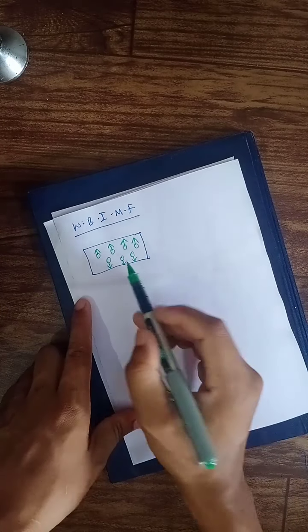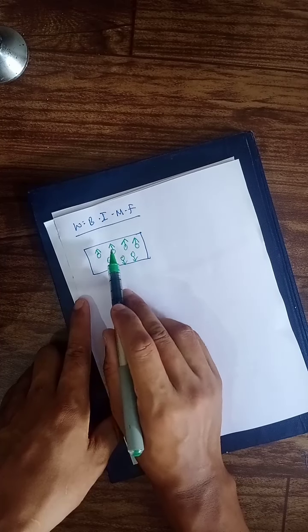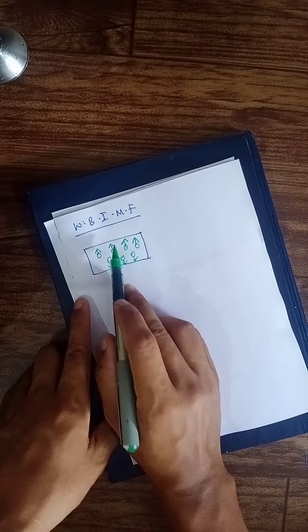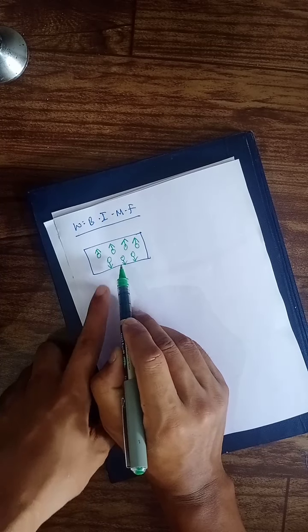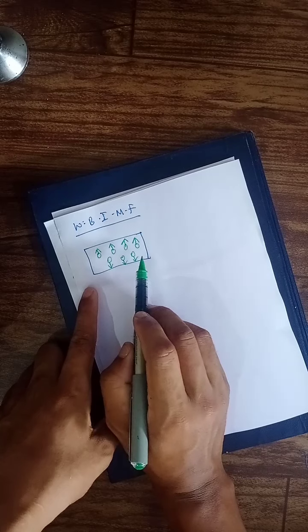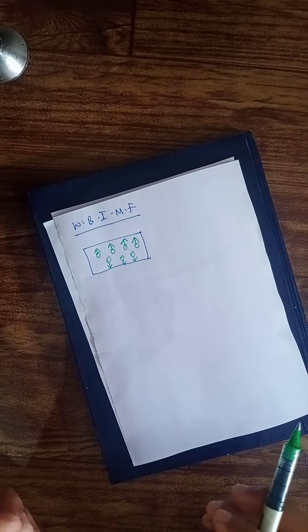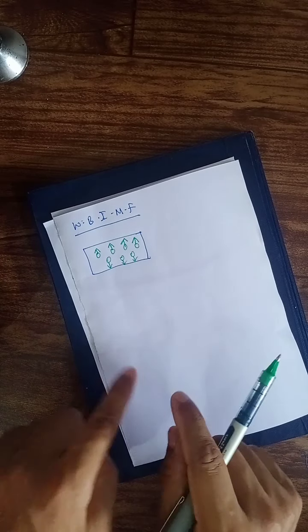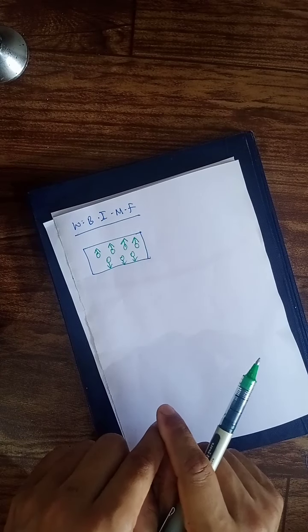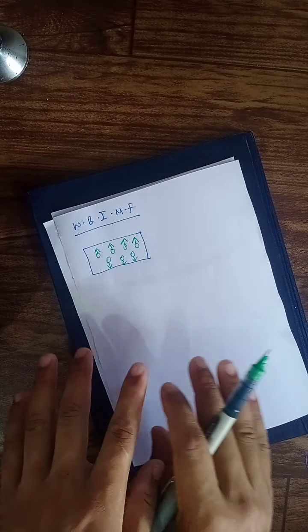So this is the alignment, but can you see the majority is directing on the top, but not top, I'll use the word parallel, and the lower number is in an anti-parallel direction. The best example I can give you is, all of us know how to walk with our feet, right? But some people on this planet can even walk with their hands, upside down.